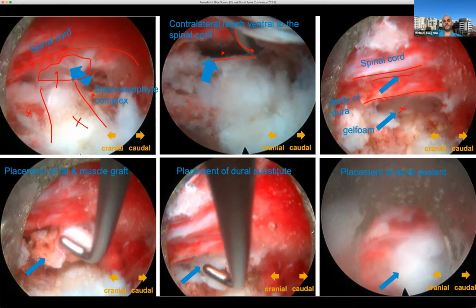And she did well, right? Again, small incision, getting to this area ventral to the sac in the high thoracic spine. Again, this was T2, T3. We didn't have to have any real interaction with the scapula there. We got kind of lucky. After a year, she's had 75% improvement of her headaches, right? She's able to bend down, look underneath tables and chairs and things like that, which she wasn't able to before. So she's very satisfied for now from that procedure.